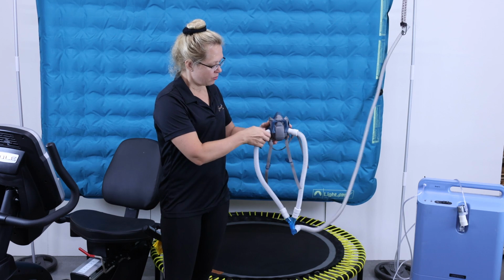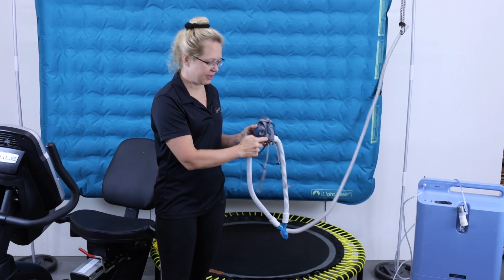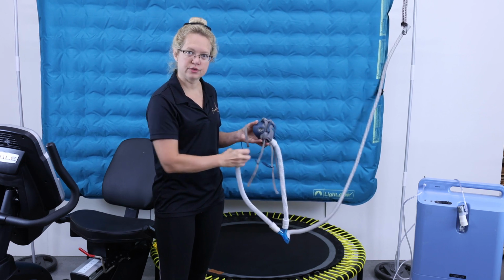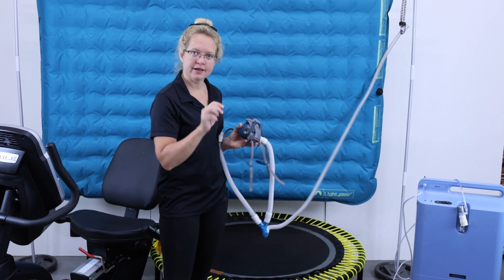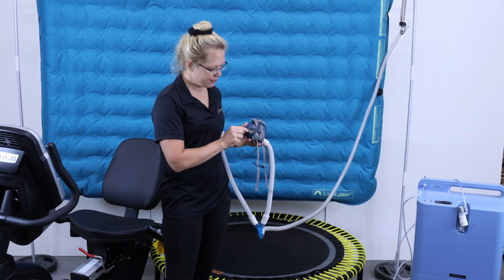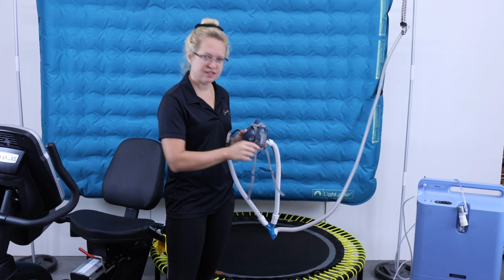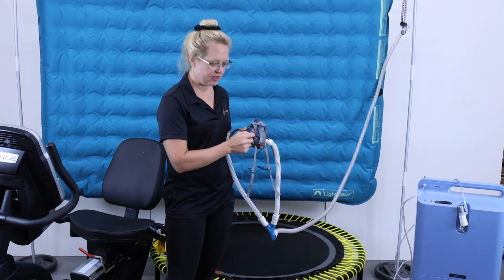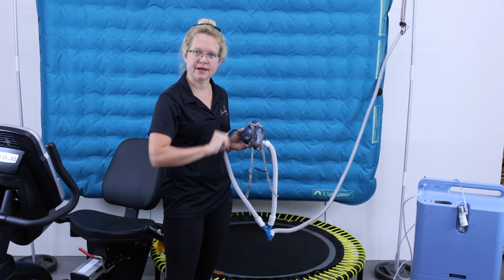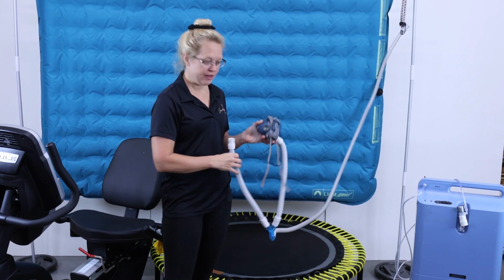This is a small medium, and then they have a large extra large, so there's usually two sizes. And then there's a little keyed feature that the cartridges click onto to attach. You have to use a file or a Dremel tool if you have it, or some snips, and cut the little keys off. That took me probably 30 minutes to modify this mask and file off the key feature. It's a little piece of plastic. And once you file that off, you have a nice smooth edge right here, and then you can use a normal CPAP hose.